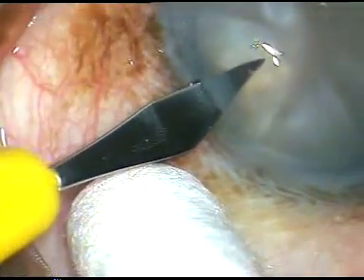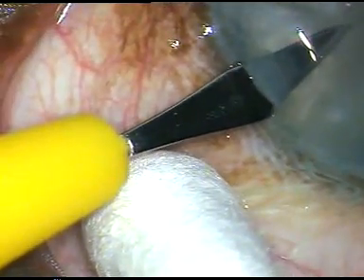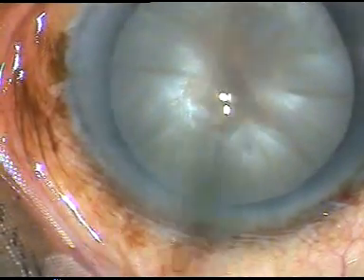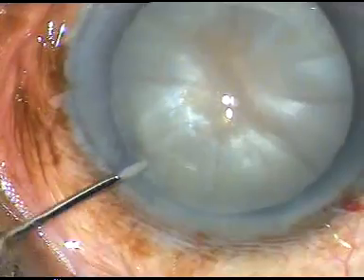Friends, this is an intumescent cataract. By this time the main incision has been made and one side port has been made on the left side of the main incision.